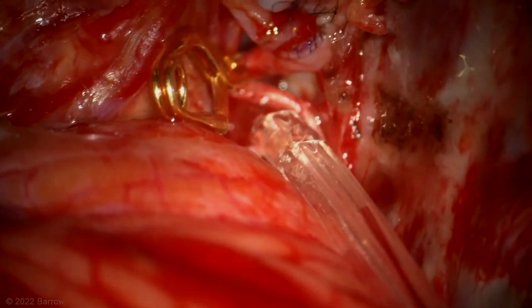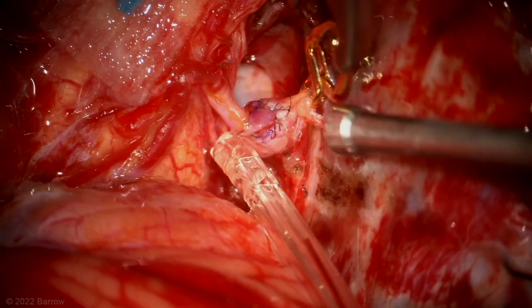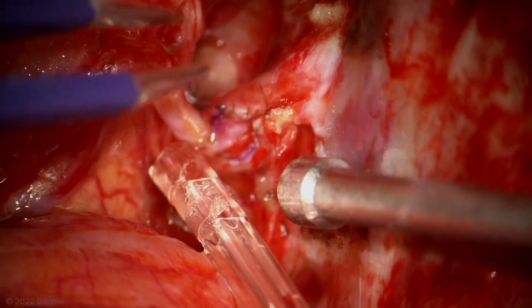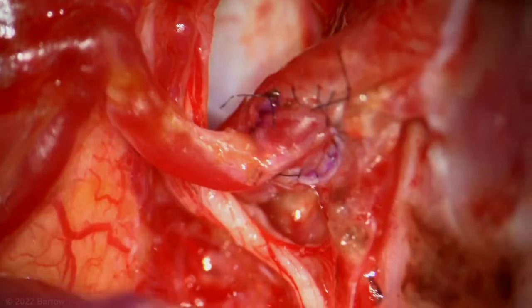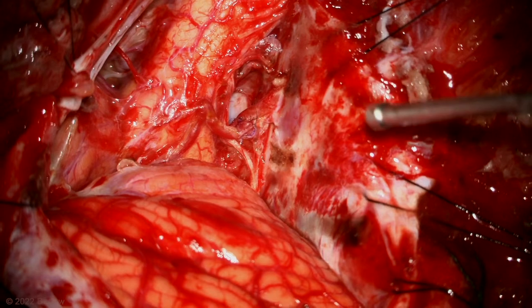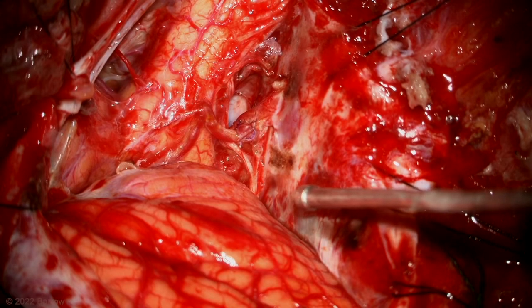The clips come off, and now there's good flow in the vertebral artery, which feeds our re-implanted PICA. There's the stump of the original PICA, which is closed off permanently. There's our nice view of the re-implantation. ICG videoangiography confirms patency of the graft with good perfusion of the medulla and spinal cord. Here's a high-powered view showing the suture work. The aneurysm has been removed, and notice how this was a nice, accessible window for landing the PICA onto the V4 segment.